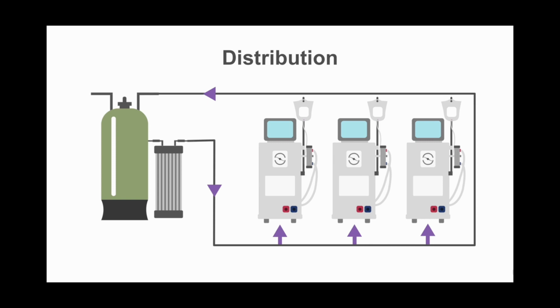Now we saw in the dialysis machine class that RO water used to come from a pipeline into the machine. We can see a schematic diagram of that pipeline here. There are 3 dialysis machines for descriptive purposes, but there can be any number, there are many ports. This is your water coming out of the ultrafilter and then being supplied to the machines.